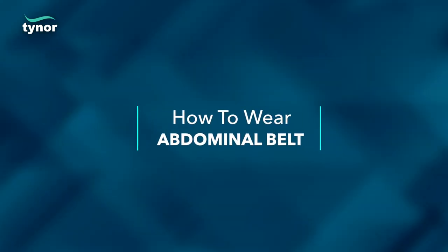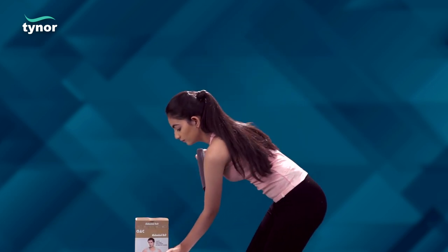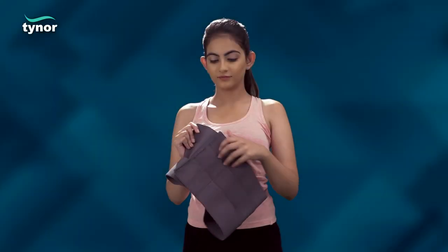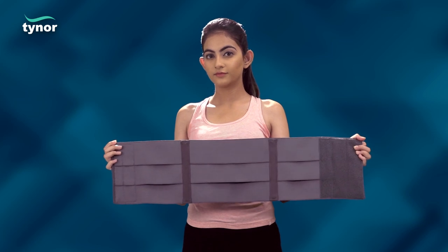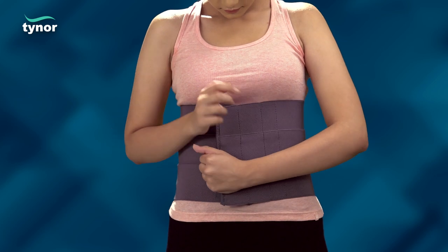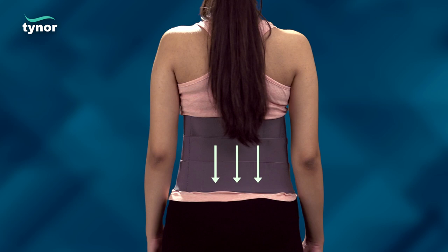Now let us see how to wear the abdominal belt. Disengage the velcro straps to make the product ready to use. The belt is wrapped around the waist and straps fastened to a comfortable compression. Keep in mind to place the lower edge of the belt coinciding with the base of the spine.